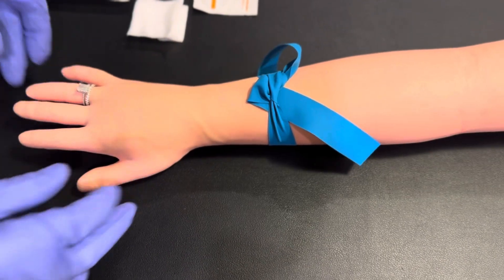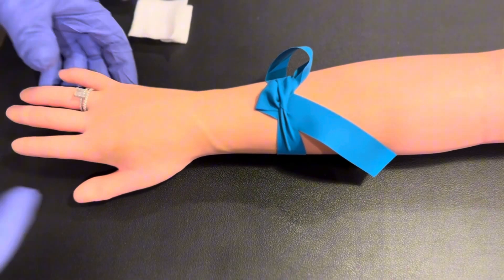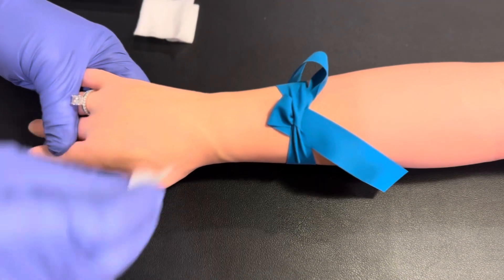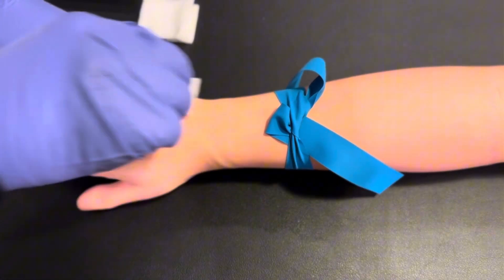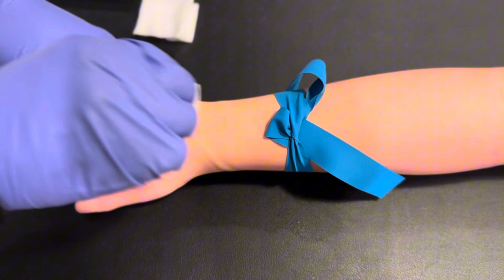Once you have selected the site, please utilize 70% alcohol to clean the venipuncture site. Clean the site in concentric circles for 20 seconds and allow the site to dry.